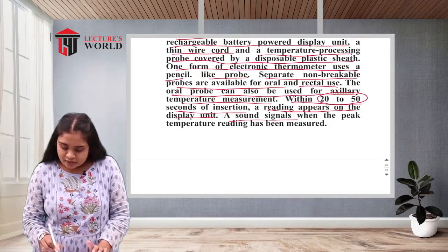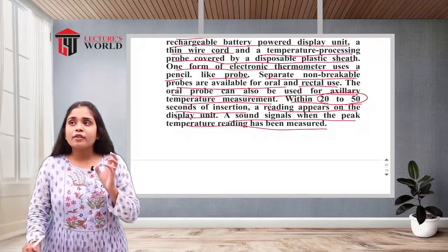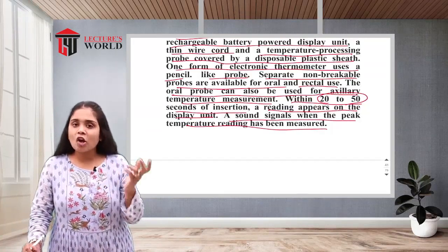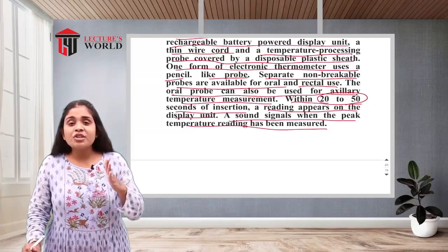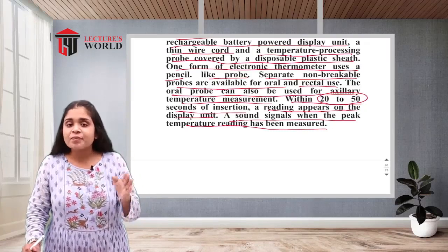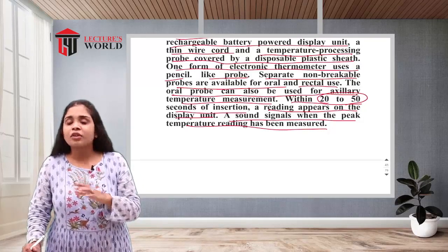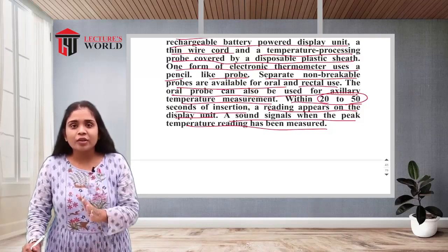There is a sound signal when the peak temperature reading has been measured. So when this probe comes in contact with the heat of the patient's body, when it reaches the peak level, the highest temperature, that time it will have a beep sound. So at that time you have to understand the temperature has been recorded.